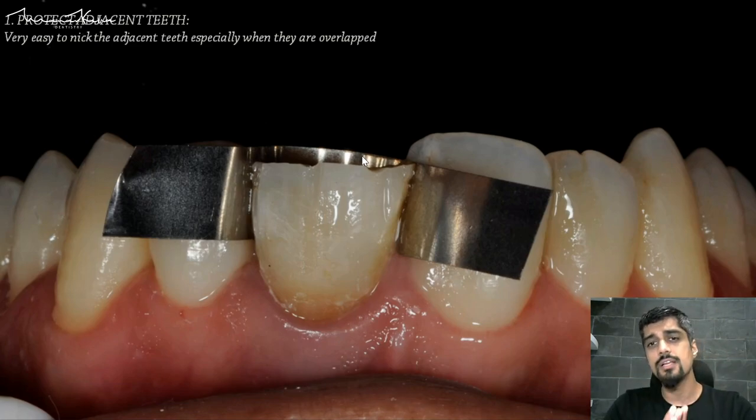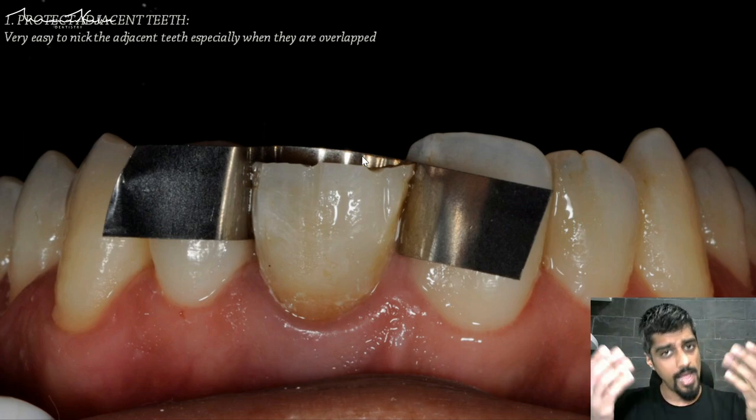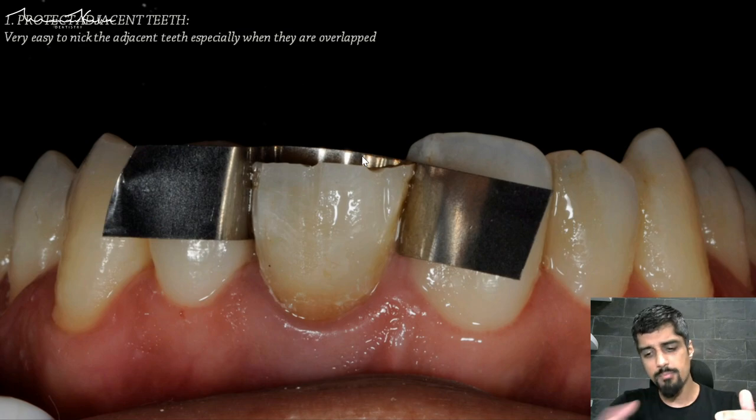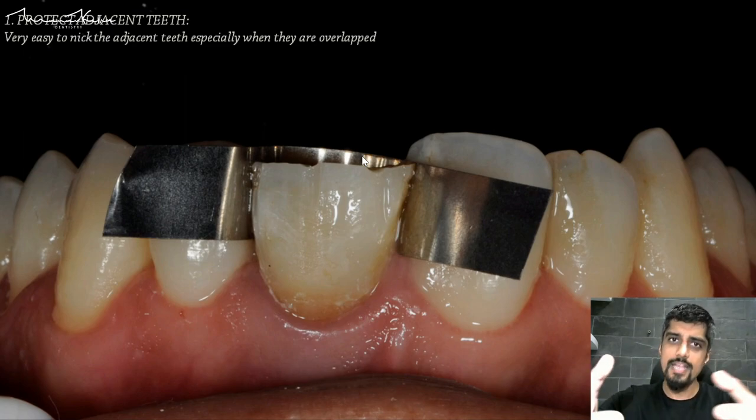In this particular case there is an overlapping, and whenever there is an overlapping of two teeth, the chances of nicking the adjacent tooth become that much higher. One of the easiest ways to prevent nicking is to take a regular metal matrix band and apply it interproximally. Sometimes if the contact point is very tight, especially in overlapping teeth, you may want to lighten the contact point with your burr, or apply two wedges to create some temporary separation so you can place the matrix band.